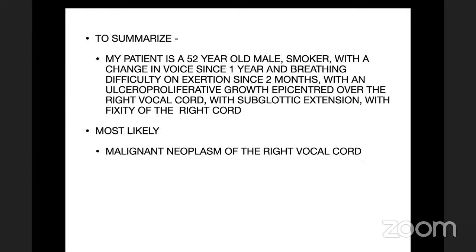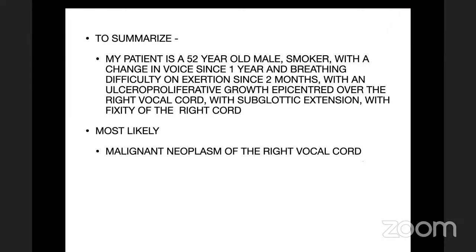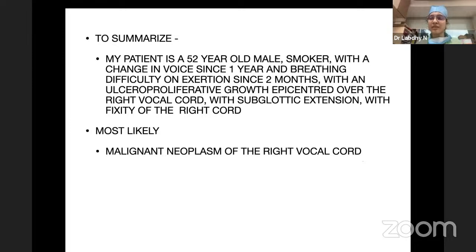Okay, you said CT scan. Why not MRI? CT scan, because we have a faster acquisition. Also we can get high resolution images. Motion artifact is not there. It is more easily available, and it is less time consuming. Also, we can check the lung. We can do thorax imaging along with it in one go itself.